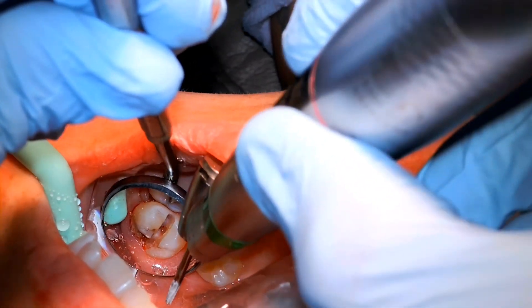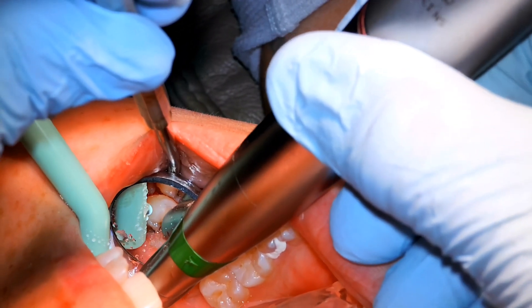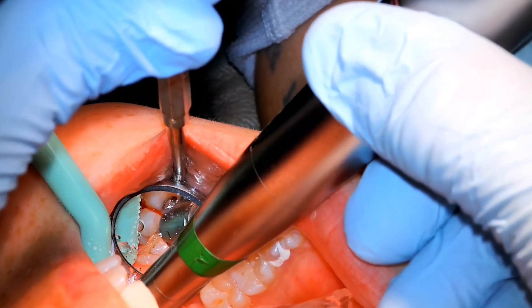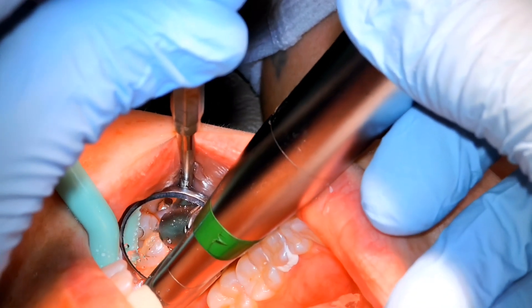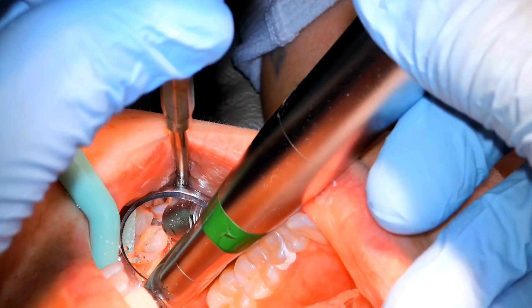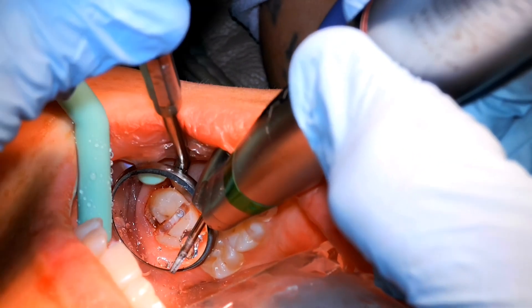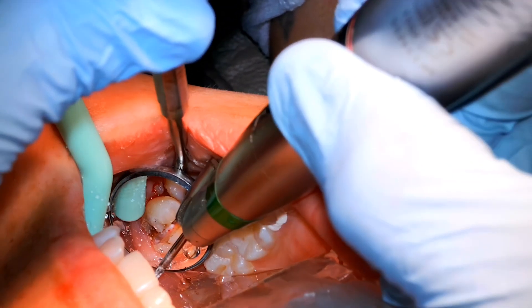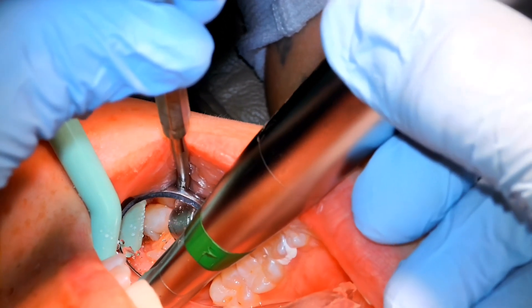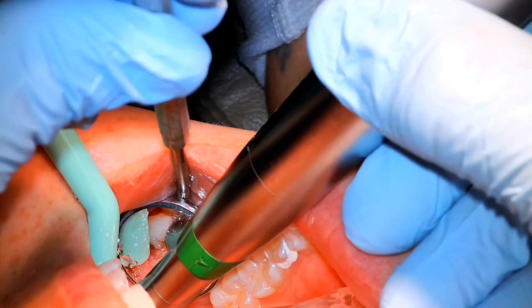The next step will be to put the elevator down in there. You can see we're down where the pulp chamber would be. We need to go a little bit further. When you look into these cuts, you'll see it bleeding — and you've got to look where the bleeding is. Get good visibility, suction it out, rinse if needed. If you've got good bleeding from the base of the section at the deepest part, typically you're through to the bone. You'll have a different tactile sense. There's still a little tooth present here, so we can still go deeper.